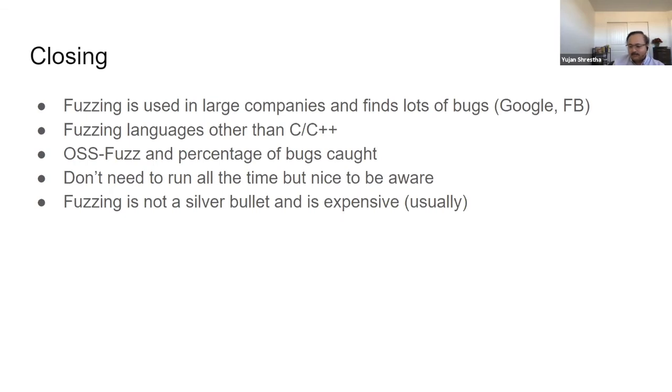I think some of the practical takeaways for me is, in 62304, you want to divide your software system into various software units. One of the main reasons for doing this is you can assign a different risk category to these software units, class A, B, and C. And the type of testing you do and the type of code review could be different for each of these software units.